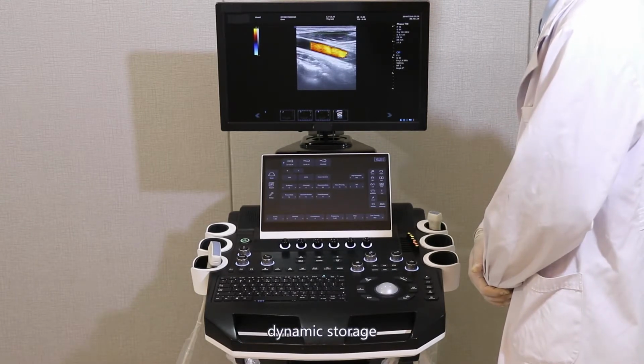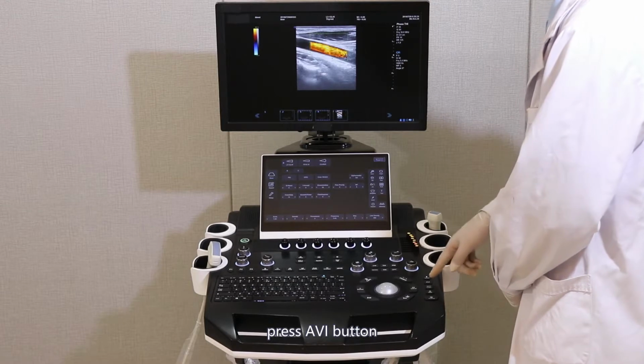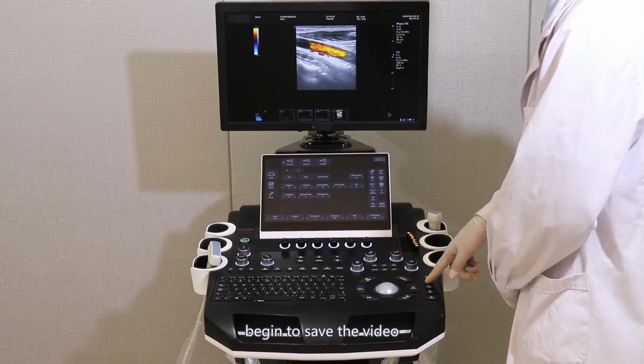Dynamic storage. Get a satisfactory image. Press the AVI button to begin saving the video. Press again to end.